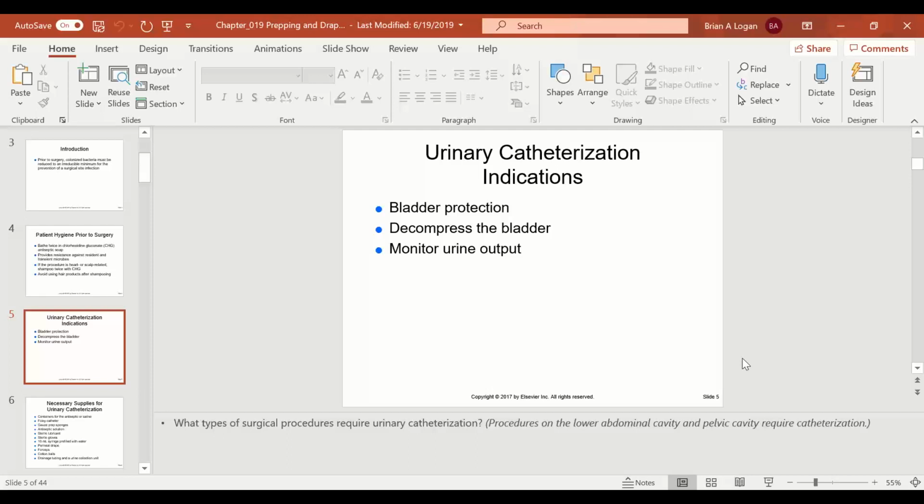So if it's in the bag, what you'll see is the nurse will save the bottle of saline that she used to pour up onto your field. And then she will empty the Foley bag into the bottle of saline, and then she can report to anesthesia how much urine they got out. What anesthesia is looking to see is that the urine output closely matches the IV input. It should be very close to the same.